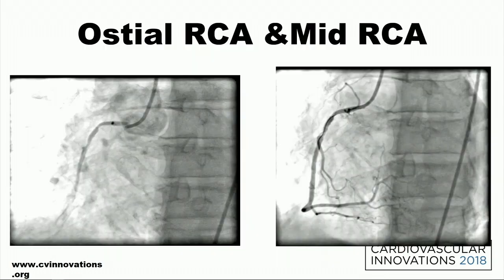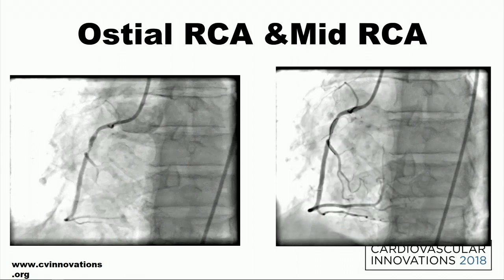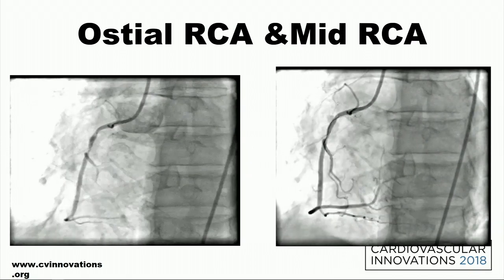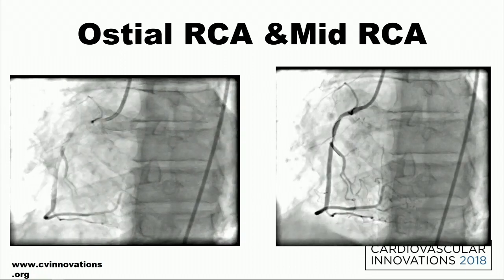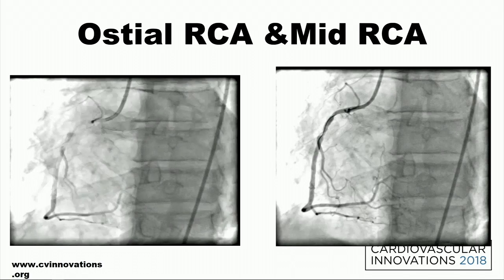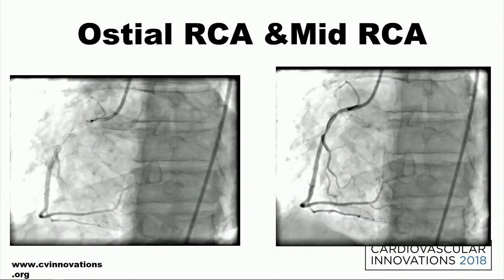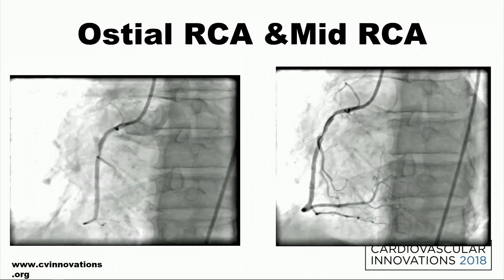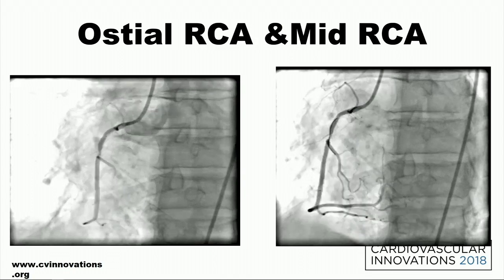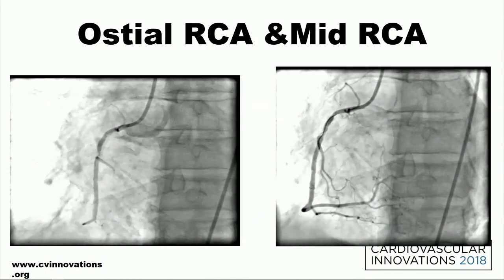This is the ECG. He had an angiogram 5 years back which was reported to be normal. In view of his symptoms, we thought we'd do an angiogram again. So we took a femoral route, and this is the right coronary artery. You can see a proximal to mid RCA 80% lesion, and the ostial RCA was quite tight. When we engaged the catheter, there was significant pressure damping.